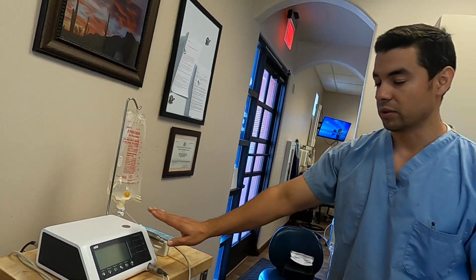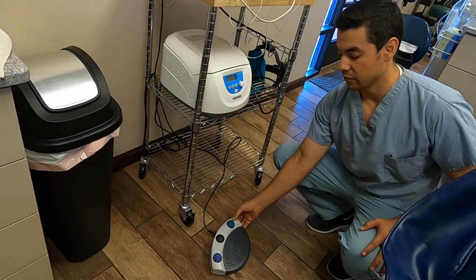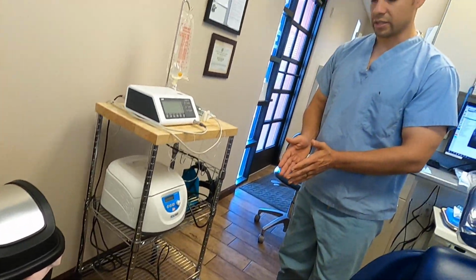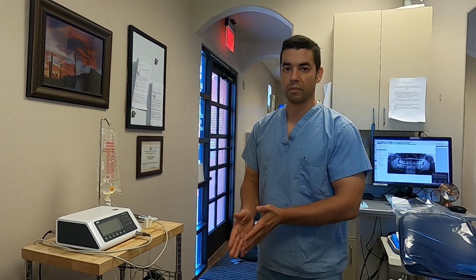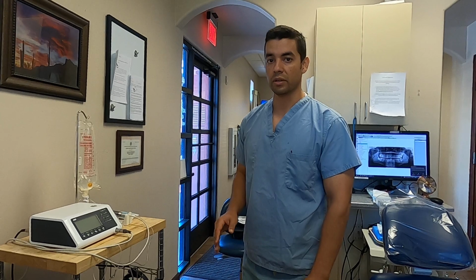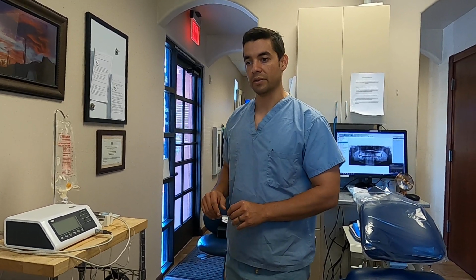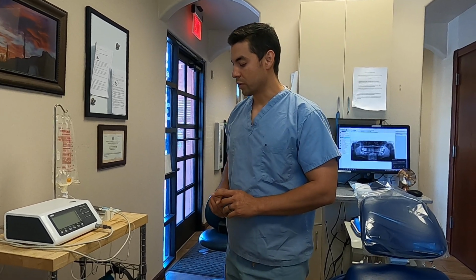We want to make sure that the unit is plugged in, and we want to make sure that the pedal is moved to the ground so that nobody has to remove gloves, touch the pedal, wash hands again, all of that stuff before proceeding to the procedure. Those little things help to make the procedure flow a little bit easier. Which brings me to another point.